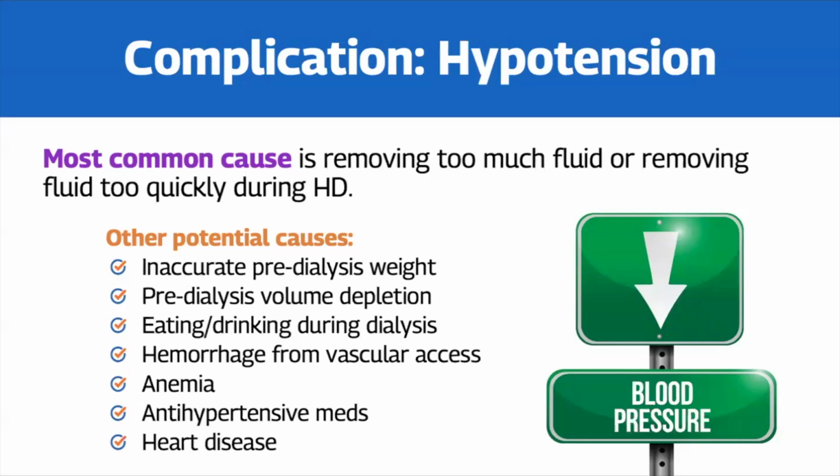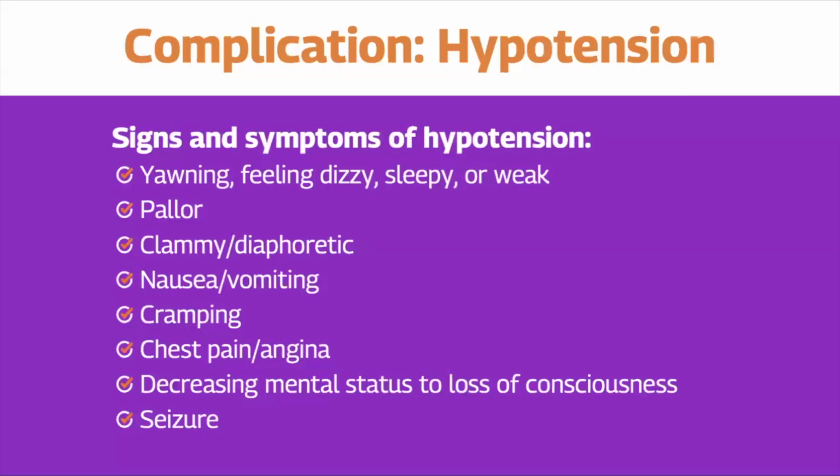So hemorrhage from vascular access can also occur. Again, you want to hold pressure on that site until it stops bleeding. Anemia is also a cause of hypotension. Too many antihypertensive meds and heart disease can also cause that problem.